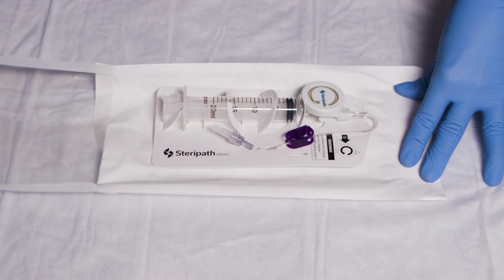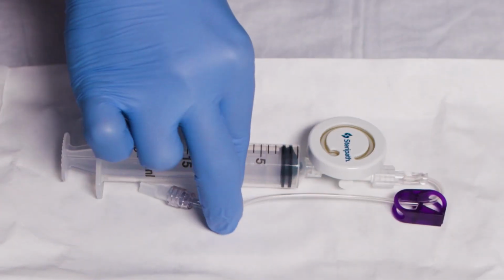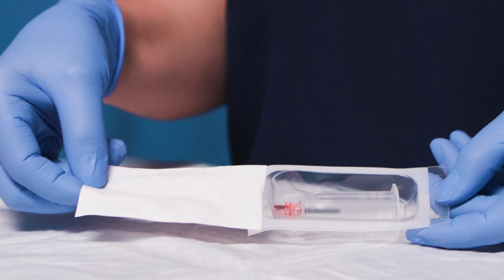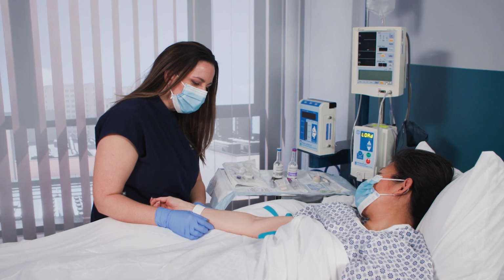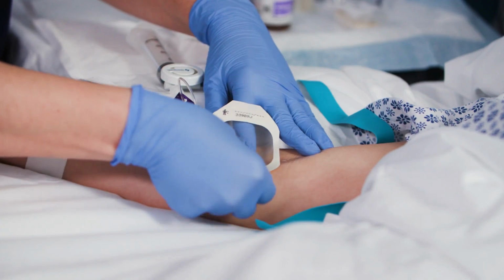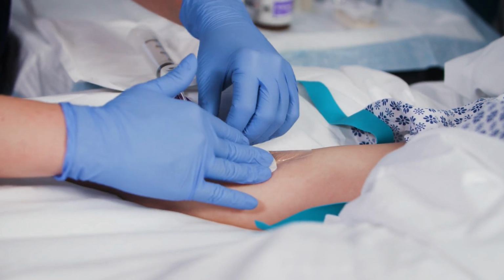Open Steripath Micro, keeping the device on sterile packaging to prevent contamination. Open blood transfer device, keeping the device on sterile packaging. Ensure site is completely dry. Insert IV catheter and connect Steripath Micro's Luer extension set before securing the site.